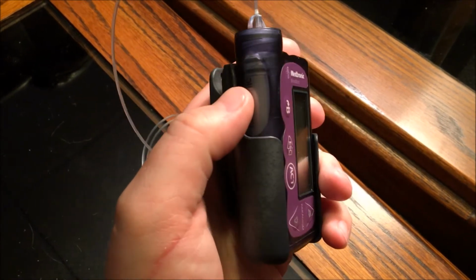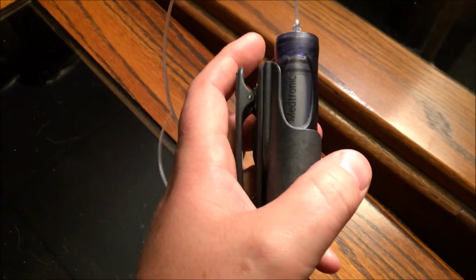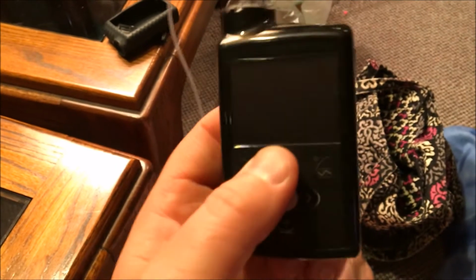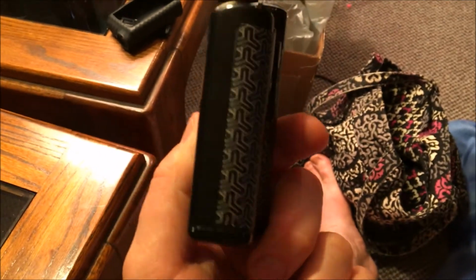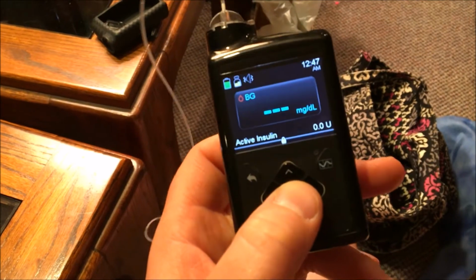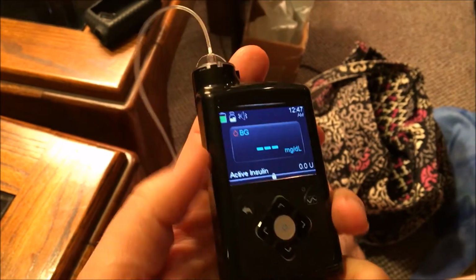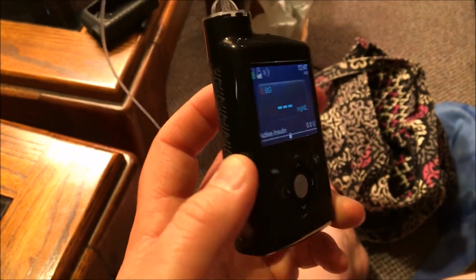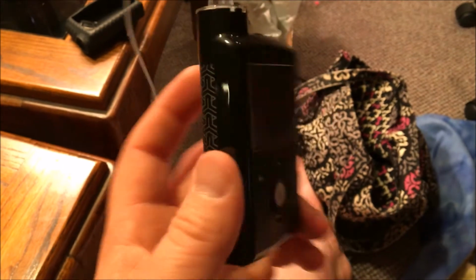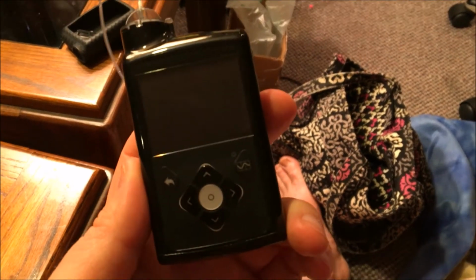I mean, there's definitely solutions for the 670, and I'll show you those, but I do miss that feature. Okay, so obviously there's no window on the 670. Takes some getting used to. Obviously it kind of tells me electronically what it is up here, and obviously I could always take this out and eyeball it, but not as convenient as before. Maybe part of that has to do with the waterproofing of this pump, so that this pump could go in the water. It's probably a worthwhile sacrifice, but it is a feature of the old pump that I do miss.